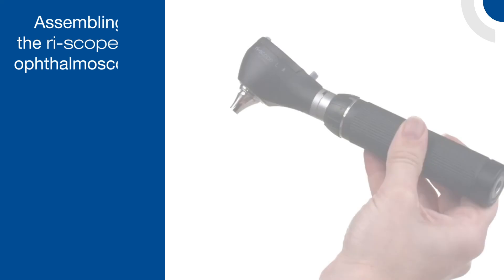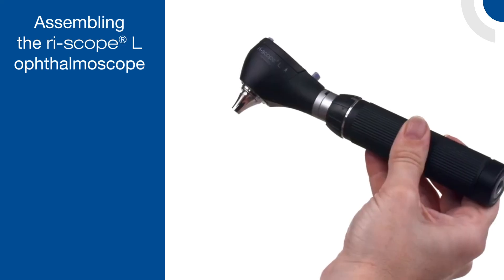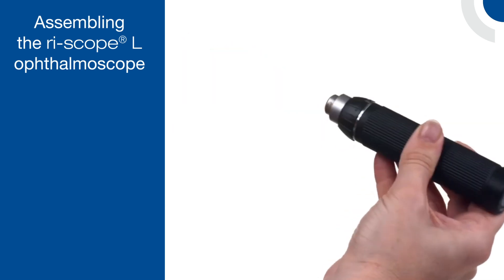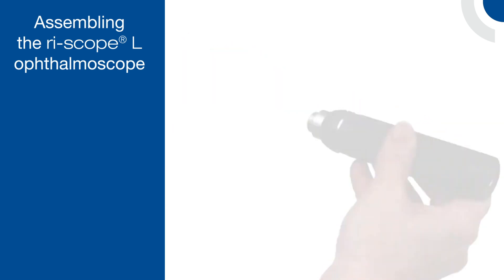To remove the otoscope head, turn the head in a counter-clockwise direction. You will feel the head lift slightly, separating from the handle once disengaged.